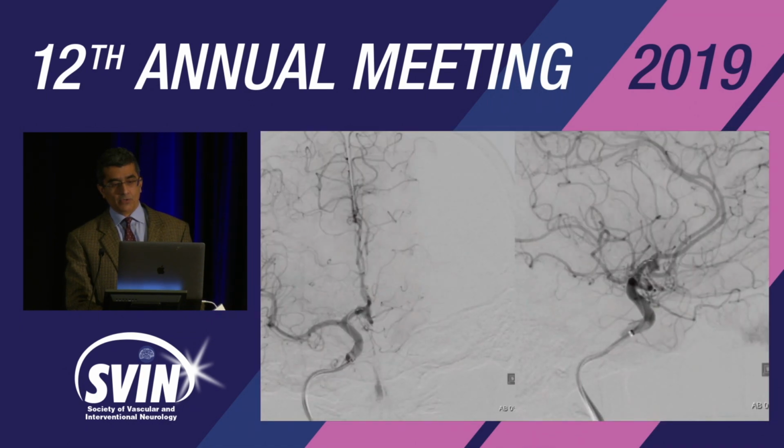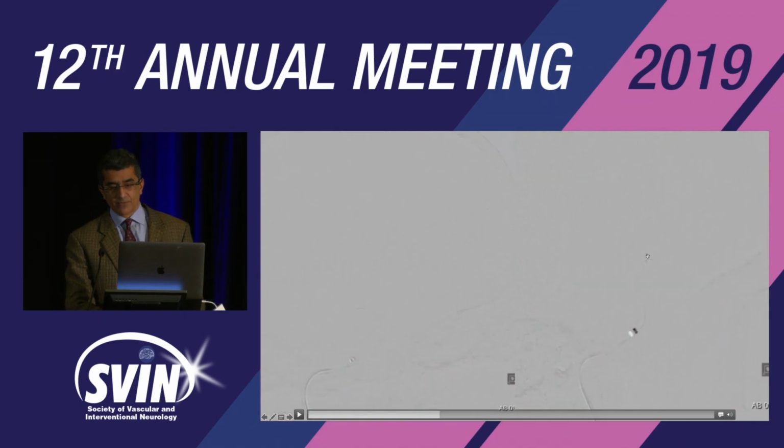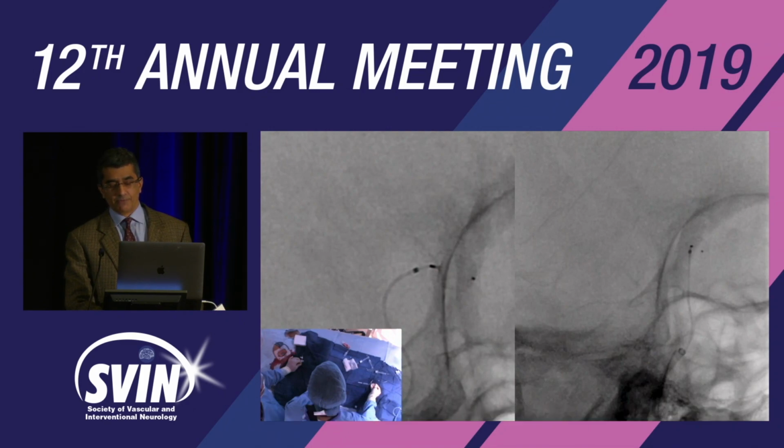We do a control angiogram before detachment. The aneurysm is already occluded. It's a pretty wide neck aneurysm. Some flow seen at the bottom half on the lateral projection, but significant stasis. So the detachment of the device can be tricky, especially if we're in a curved anatomy and the force on the catheter will try to move it up.